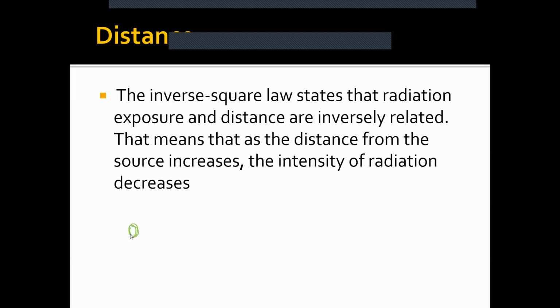Here you have your source. Let's say you have your patient here, and then another patient here. This patient is getting hit by all of these x-rays, whereas for this patient, a lot of those x-rays are going to miss. All right, that's basically the principle for distance.